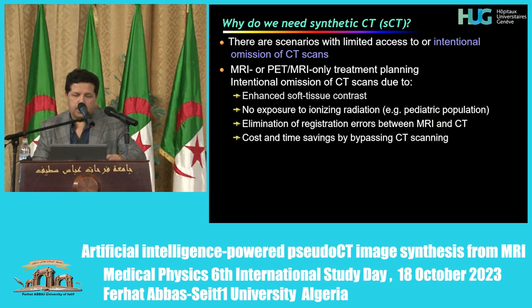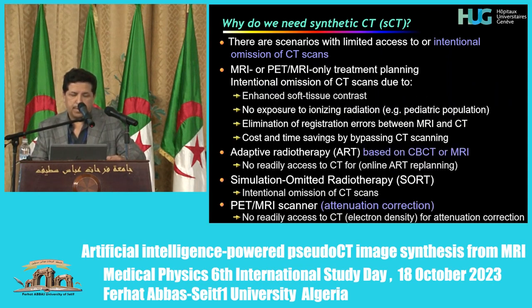So why do we need synthetic CT? There are a number of scenarios in the clinical setting which require avoiding doing a CT scan in addition to an MR scan. MR or PET-MR only treatment planning is a typical application. The idea is to take advantage of the high soft tissue contrast provided by magnetic resonance imaging. There is no radiation exposure, as you know, compared to CT, which is especially important for the pediatric population.